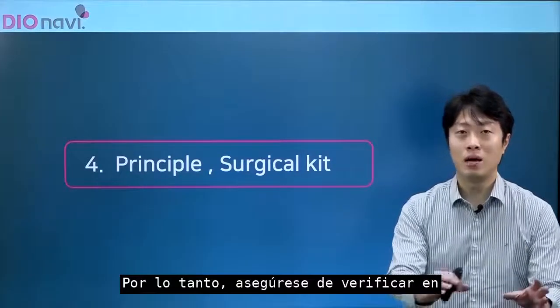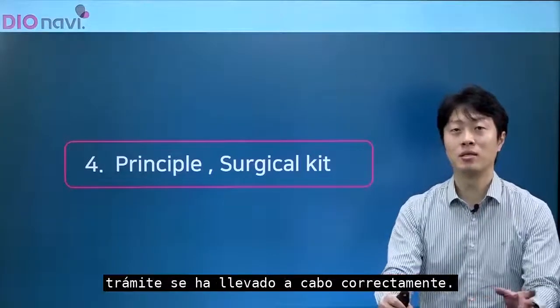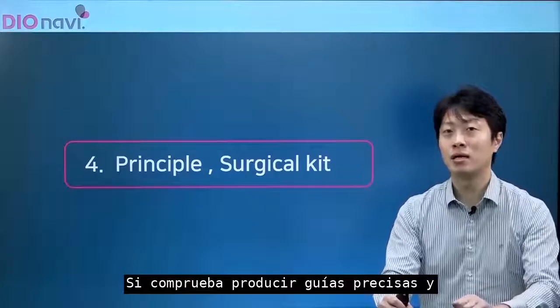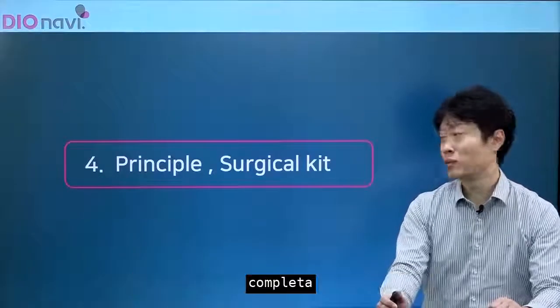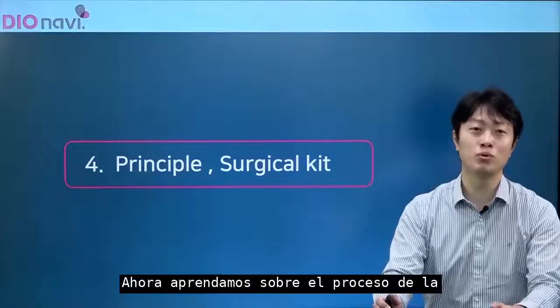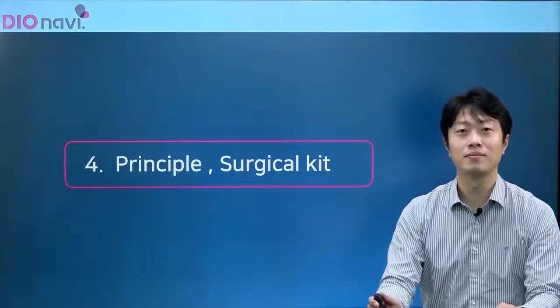So please be sure to check every step of the way whether the preceding process has been carried out correctly. If you check, produce accurate guides, and perform surgery with them, you will be able to operate more accurately and completely. Now, let's learn about the process of surgery in detail.